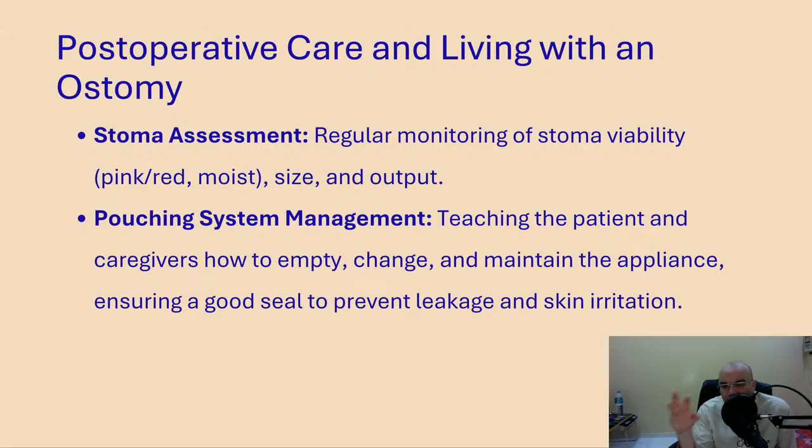In both cases, the patient should get proper instructions before and after the surgery on how to deal with the stoma, choose the suitable size for the base, apply the bag, and so on and so forth. This is important, and also to make sure we are protecting the surrounding skin.